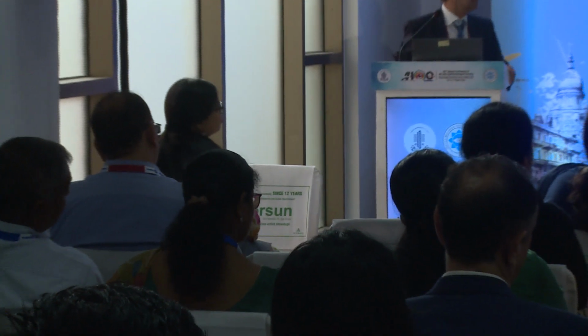Dadas, I have a question for you. When you showed these beautiful images, you're doing simultaneous FA and OCT in the same patient? We did a pilot study with Dr. Shishir Narayan some years ago where we did do that. Now, since we are confident about the OCTA, we are not doing it simultaneously. But when we got the OCTA new, we did it on both in the same patient.